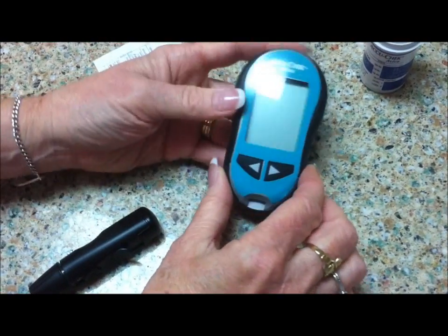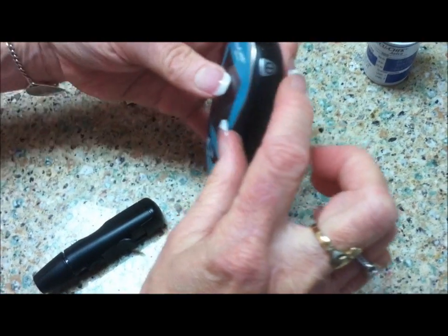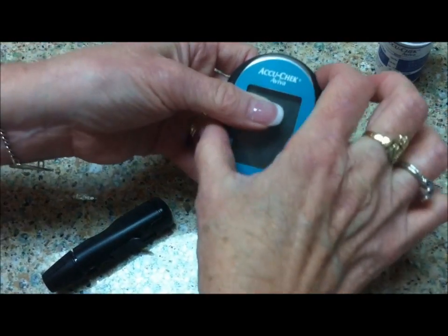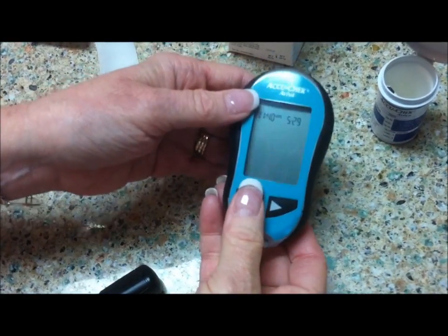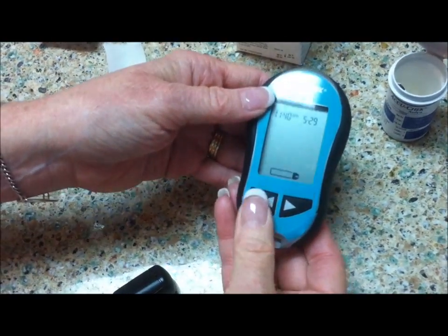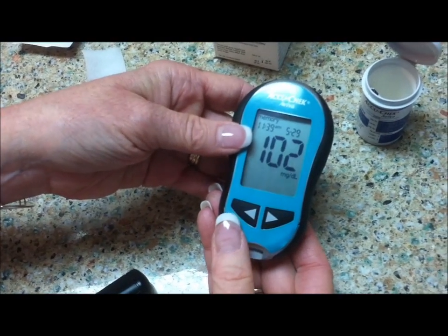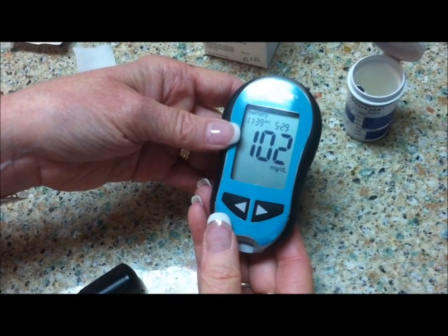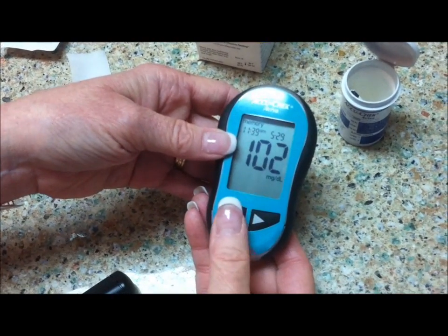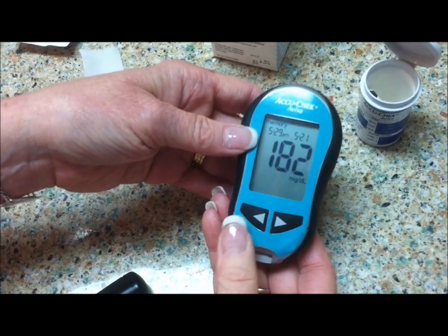Once the meter goes to sleep, you can turn it on by pressing the button at about 1 o'clock on the meter. You get the date and time. But if you use the back arrow, it will give you the last blood glucose reading stored. So if the meter goes blank before you've written down your result, you can use that — it will go back and hold many previous blood glucose readings.